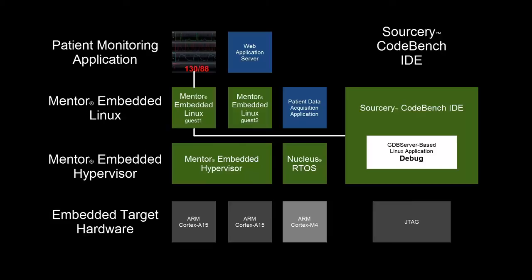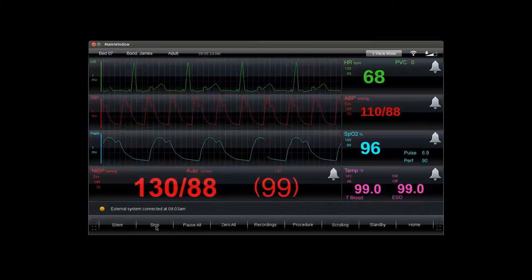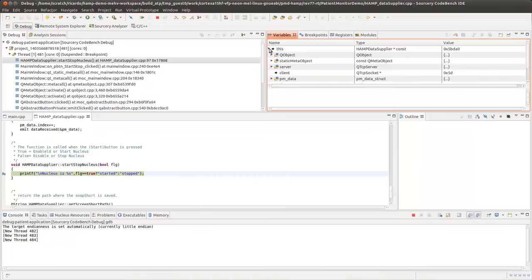Sorcery CodeBench also supports GDB server-based debugging, illustrated here with a breakpoint in our patient monitoring application. By pressing the Start button, we trigger the breakpoint and can examine the state of the program at that time.